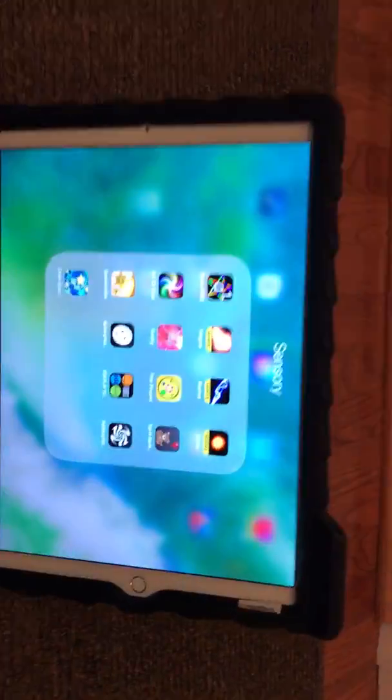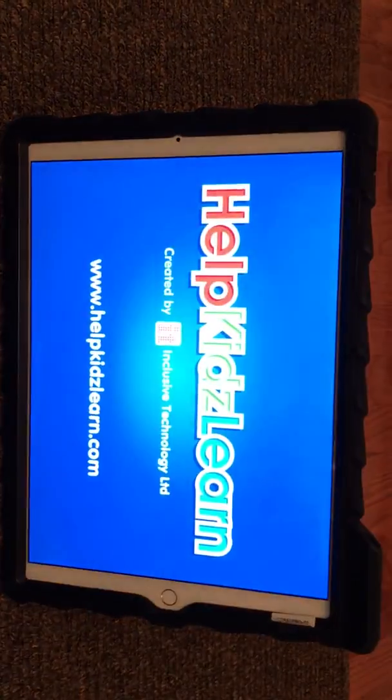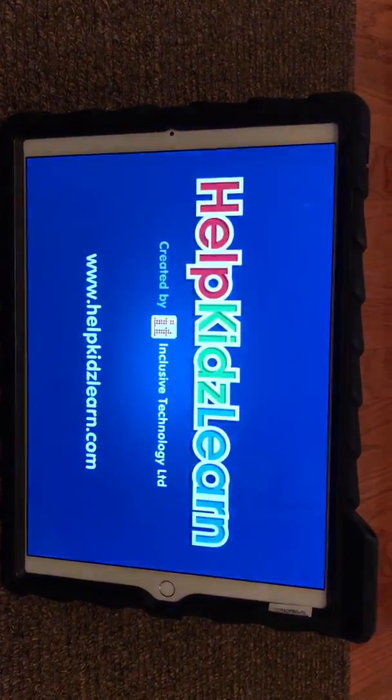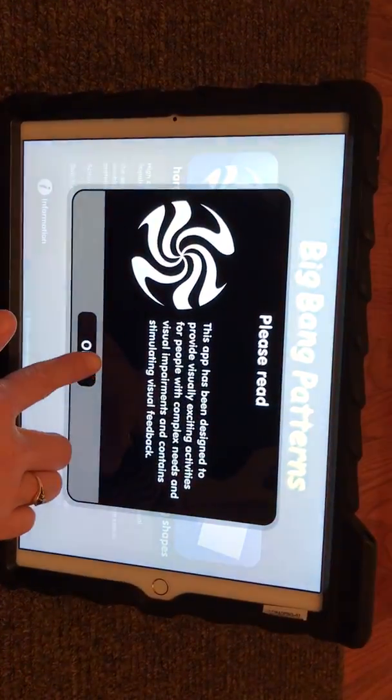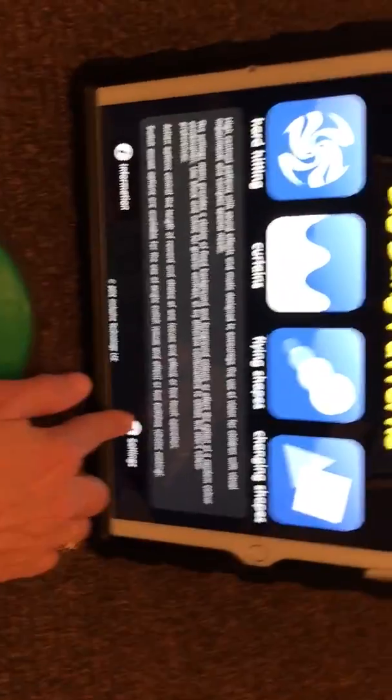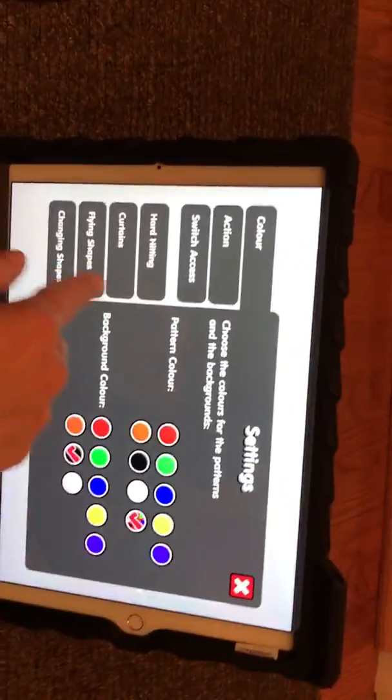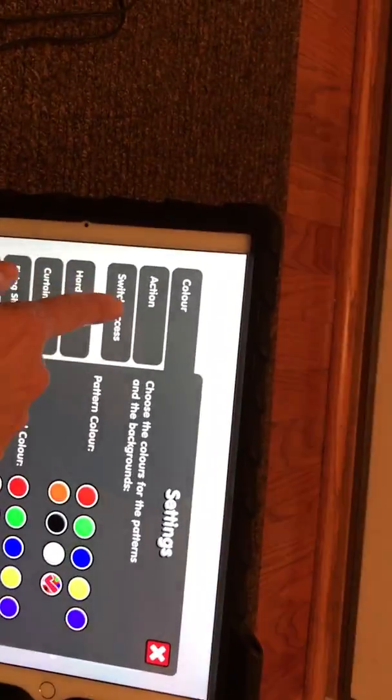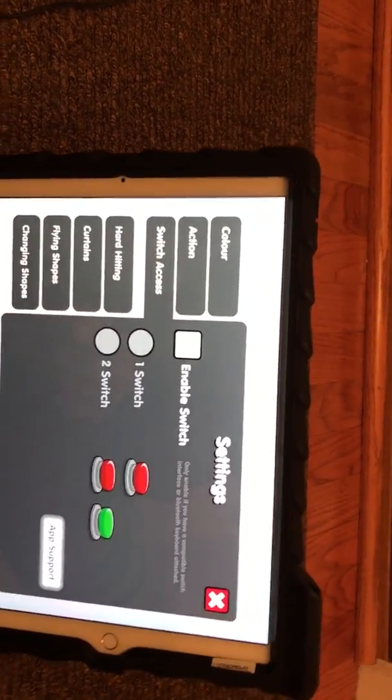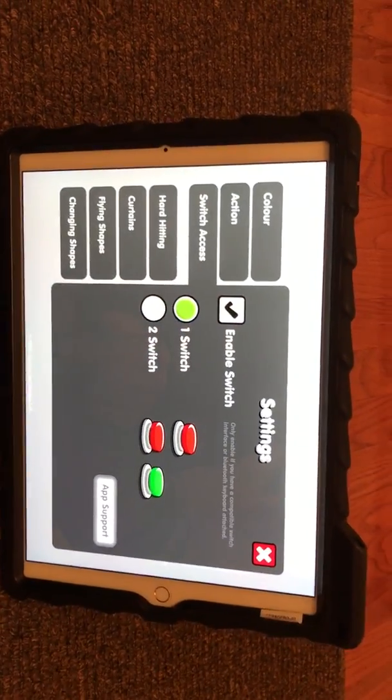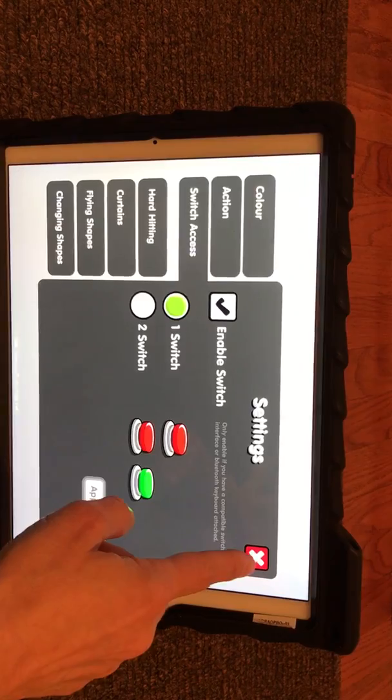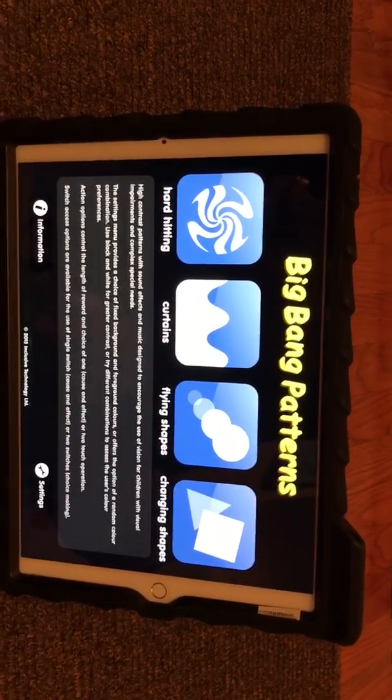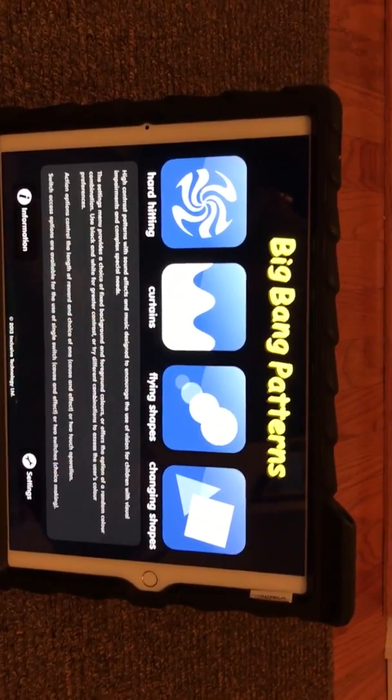The same thing works with Big Bang Patterns. Whenever you open it up, it will allow you to go into Settings down here at the bottom, and then you have to hit your Switch Access and enable your switch to be able to use it. Exit out of that, and then there's four different choices of shapes that you want with this program.